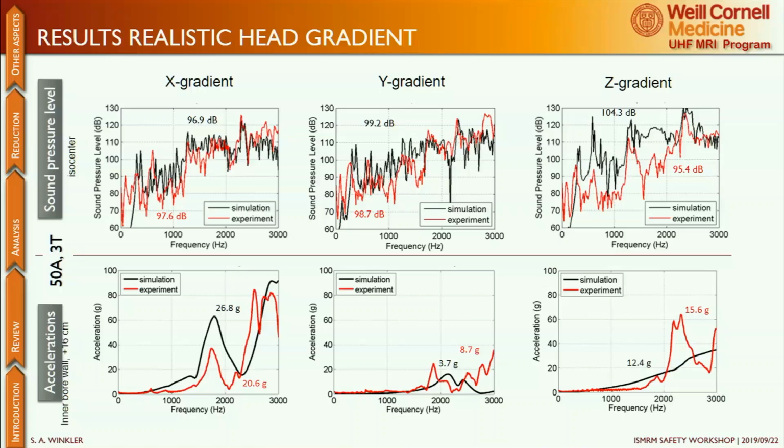So if you look at different Young's moduli for the epoxy shells, so stiffer gradient shells, the accelerations here are very different, but these resonances don't really show up at the top in the acoustic spectrum, which is important to note. So we can sort of decouple these effects. So we think that the average sound pressure level is determined more or less by the stiffness, and then the spectral shape is determined by the shape of the air bore of the gradient.